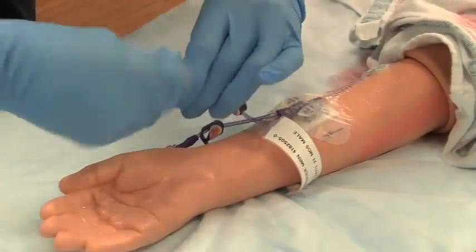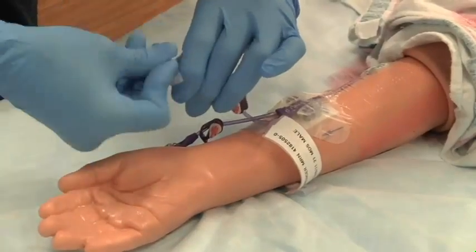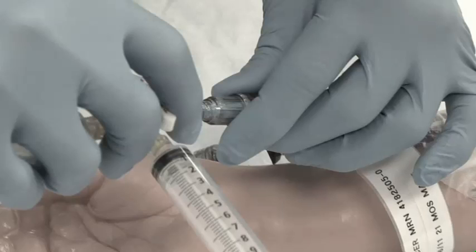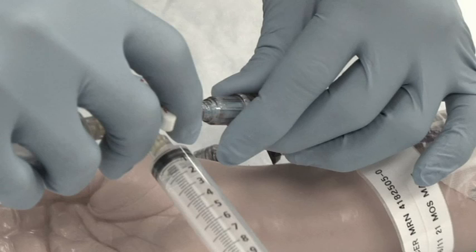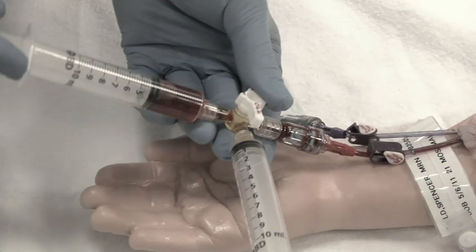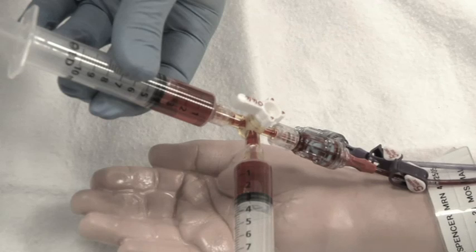Scrub the hub with alcohol wipes for 15 seconds and allow to dry for 15 seconds. Connect the stopcock with the two 10-milliliter syringes to the patient's catheter. Draw a discard from the catheter of a total of 3 milliliters. Turn the stopcock off to the waste and open to the specimen syringe, then withdraw the appropriate amount of blood sample.